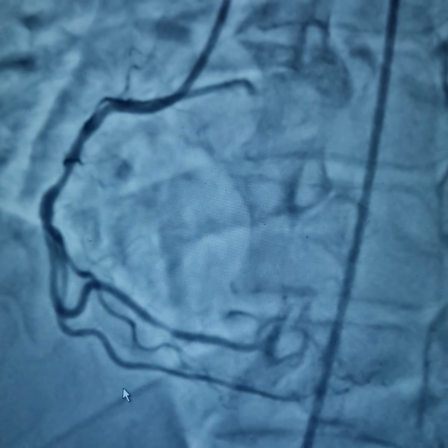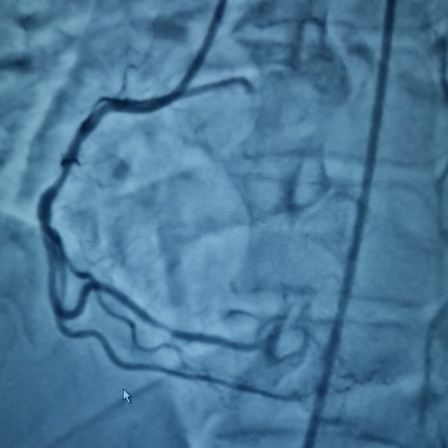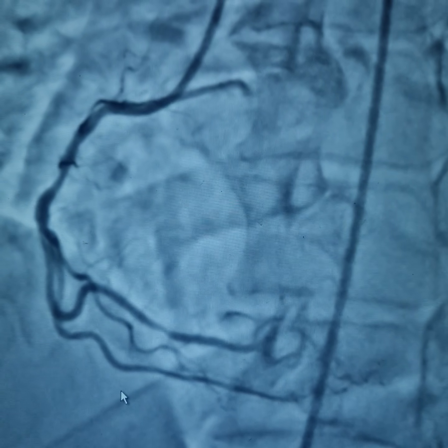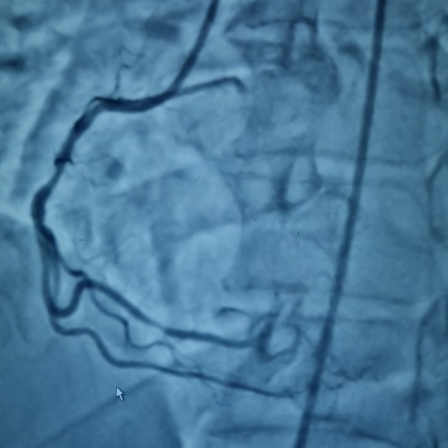So in this case, we're looking at the RCA. We've already hooked the RCA. The radial artery was already punctured somewhere else, not at our hospital, and it was not palpable. So we had to go for a femoral access in this one.